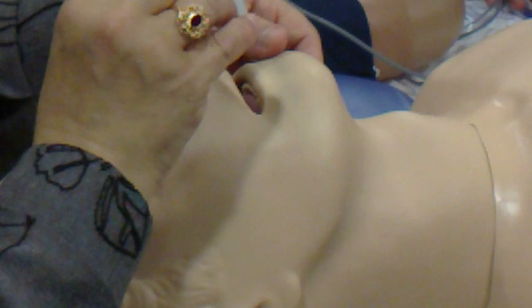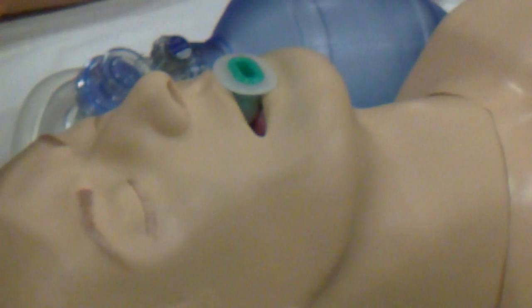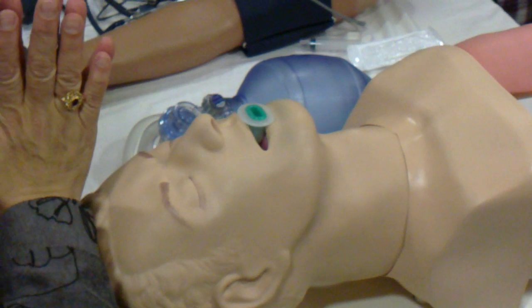Then you will put it upward till half, a third, or midway, and then rotate it 180 degrees, and then put it like this. Okay? This is how you insert the oropharyngeal airway.